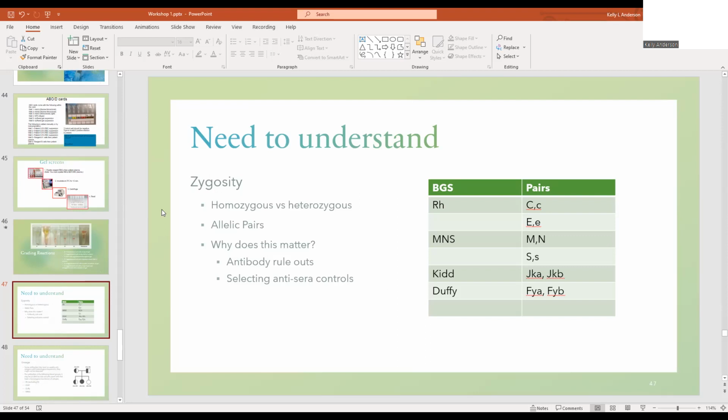So talking about AHG, there is poly AHG and there is mono AHG. If you have anti-IgG, it only has anti-IgG in it. Poly AHG has anti-IgG and anti-complement in it. So different labs will have different policies. Some use poly, some use anti-IgG. Complement is usually detected in cold antibodies, which are usually not clinically significant. So we only use anti-IgG because we don't really want to see reactions to complement. So we will use just anti-IgG, should be in your wrap.